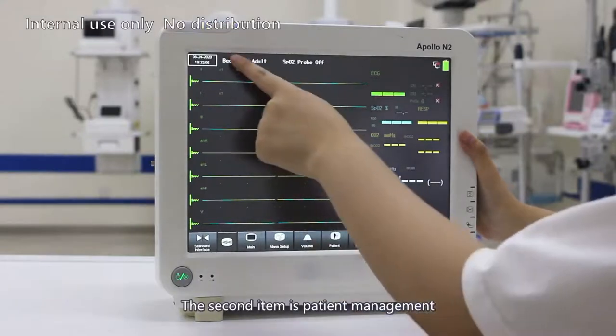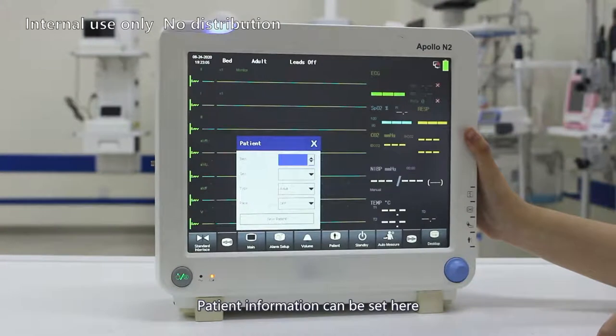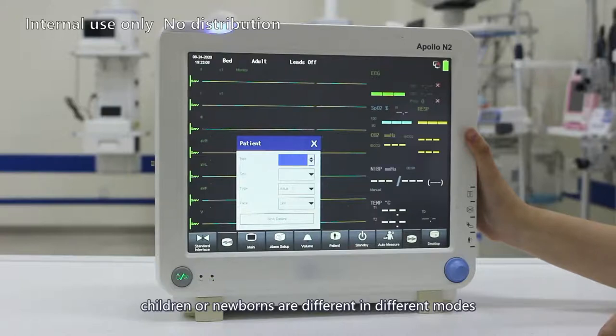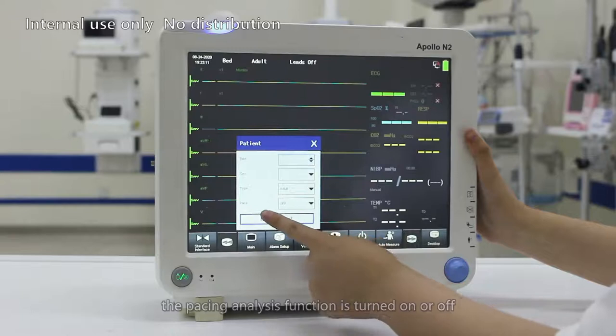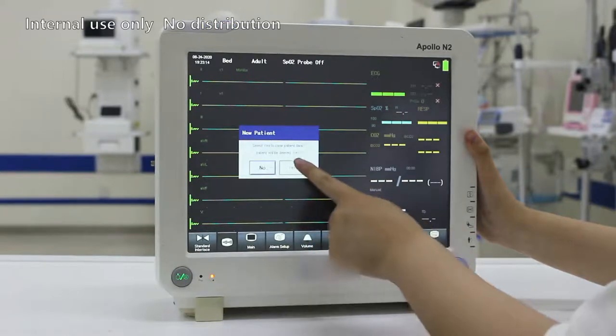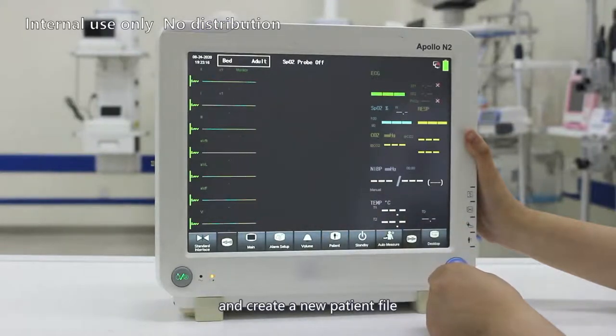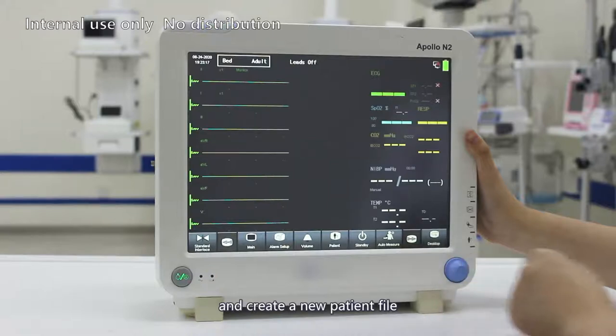The second item is patient management. Patient information can be set here, and the default alarm limits for adults, children, and newborns are different in different modes. You can choose whether the pacing analysis function is turned on or off. Click this option to clear the existing data and create a new patient file.